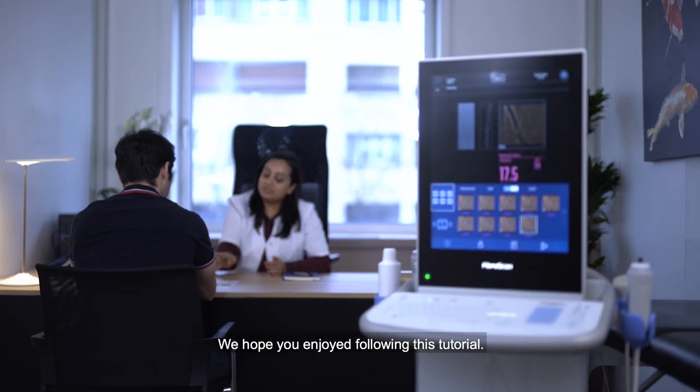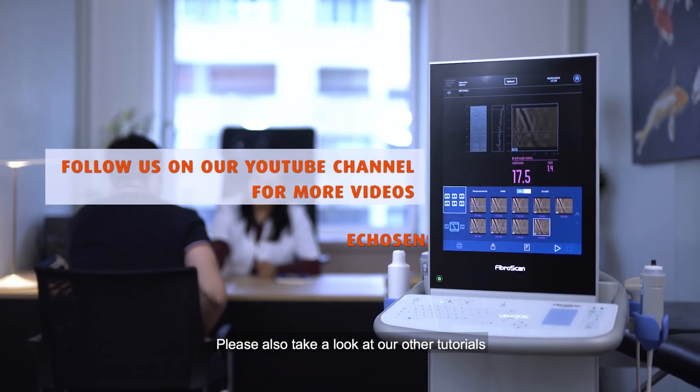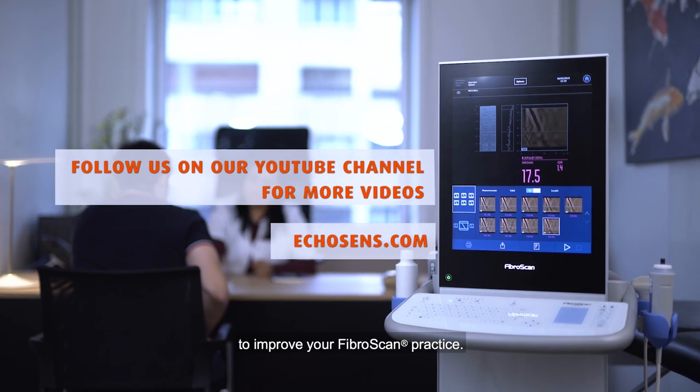We hope you enjoyed following this tutorial. Please also take a look at our other tutorials to improve your FibroScan practice.